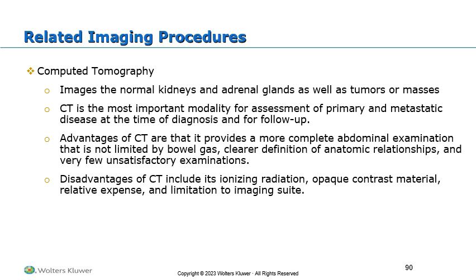Some of the disadvantages of CT are that it's expensive. The radiation doses are really high. It too uses contrast media, which could cause a reaction, or the contrast media can be very hard on the kidneys. But CT is wonderful when it comes to finding a kidney stone, looking at extensive tumors and masses. It doesn't give you a ton of detail, but just seeing where it's located can be a really good starting point. And especially not knowing how far something extends or where a metastasis has spread to, that overall global view that this gives is really beneficial.